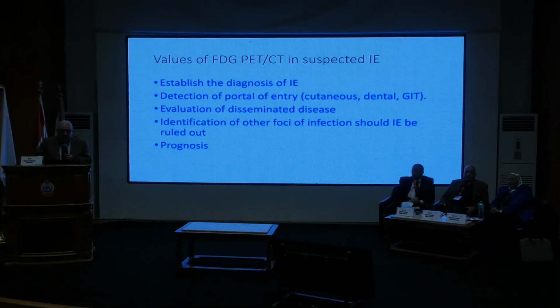And of course, it can detect other causes for the patient's symptoms, including infective endocarditis. And some people say it has prognostic significance.